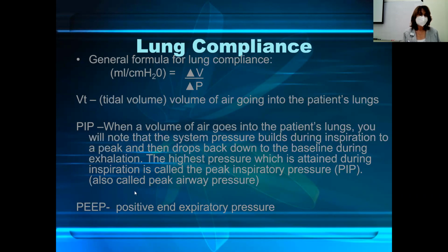All right, now to tell you about PEEP. PEEP stands for positive end expiratory pressure. And this is like the baseline pressure that stays in the lungs at all times.